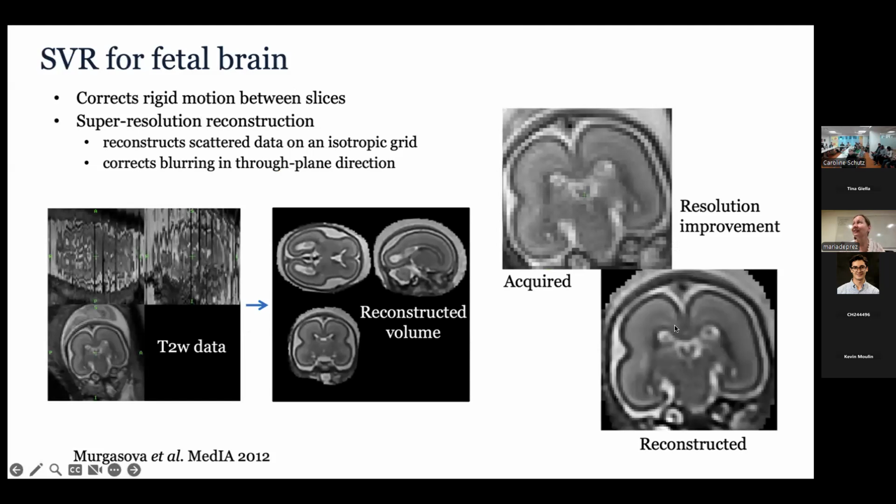It's much clearer. It's very difficult to say whether we really achieved better resolution or not, because theoretically we should be reducing the blurring from the slice thickness. I haven't measured it. I can't guarantee we definitely succeeded, probably a bit at least, but it does look like we probably did. And what's your final resolution? Is it 0.9 millimeter? I tend to reconstruct at 0.75, but that's not to say that you truly have 0.75. I don't think so. It just reconstructs nicer like that.